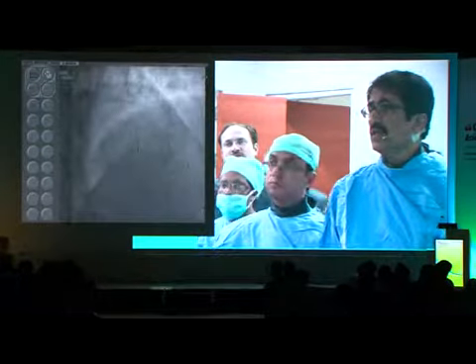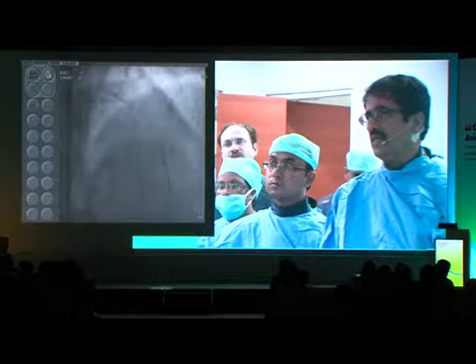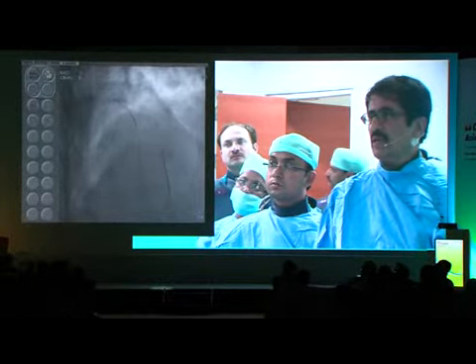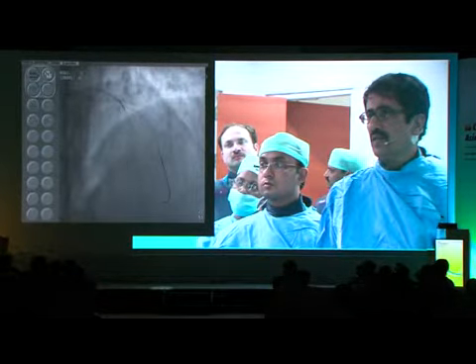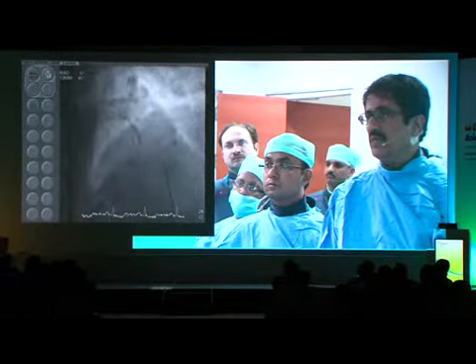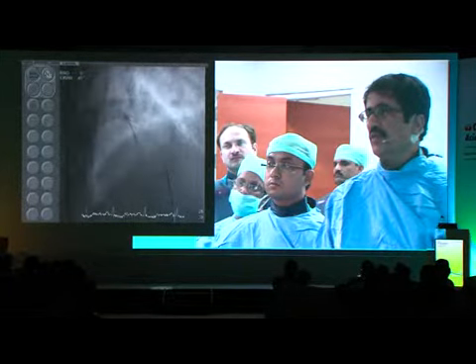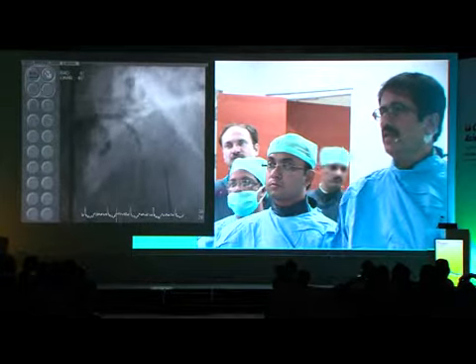Next, here we thought we will change and send the stent in a regular fashion. And this is how it is. We are treating LAD as the main branch and diagonal as the side branch. And the stent is in position now. The mid marker should be at the origin of the diagonal. Then you inflate the main branch balloon.